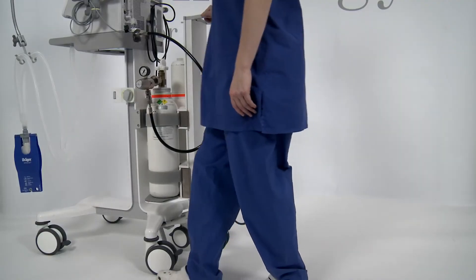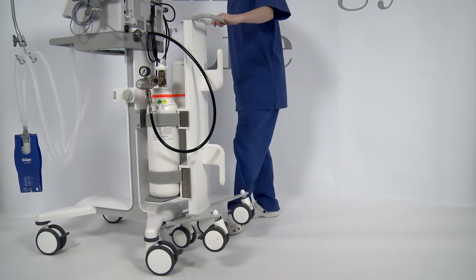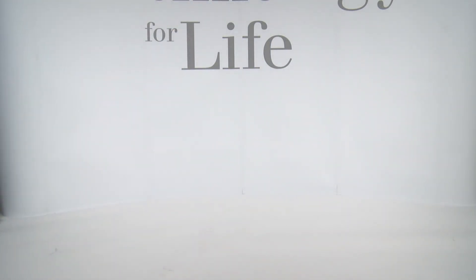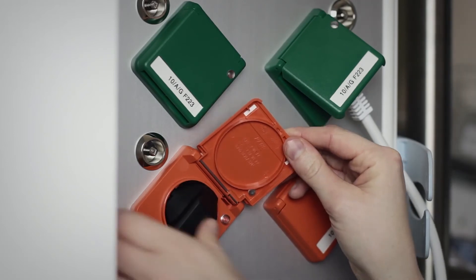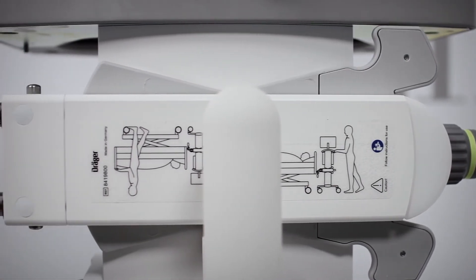Release all locking brakes and move the ventilator by the handle. Caution: only start transporting patients when the batteries are sufficiently charged. If the batteries are not charged, Savina 300 cannot ventilate. Immediately connect the device to the mains power supply again following patient transport to ensure that the batteries are being charged. For transporting patients, the trolley of Savina 300 can be coupled on a bed.